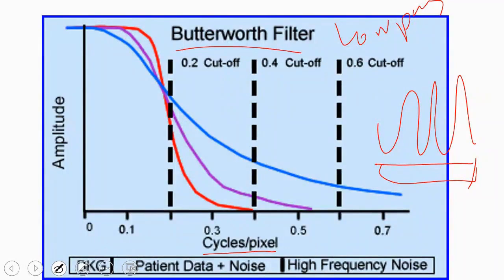Remember the topic of pixel size and how it relates to resolution. If your pixel size is small, does the resolution increase or decrease? What does the entire resolution depend on? If your field of view is large, the pixel size for the same matrix will increase, which will reduce the resolution because of the pixel size.